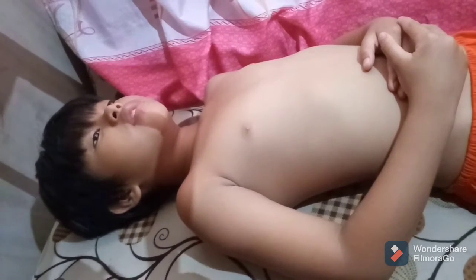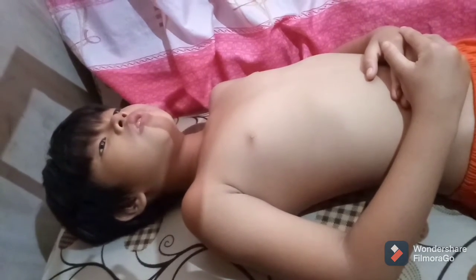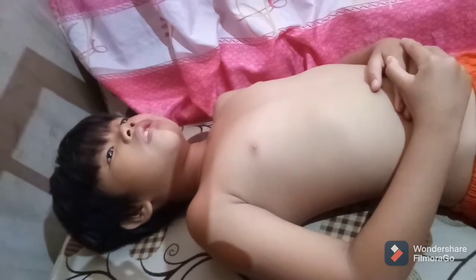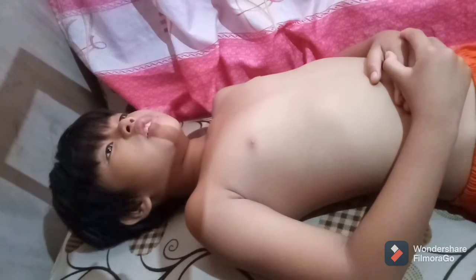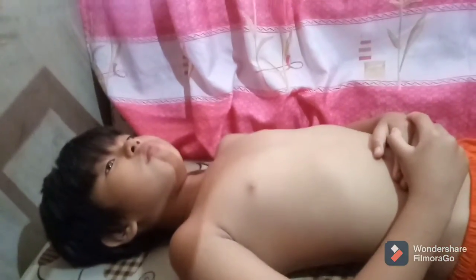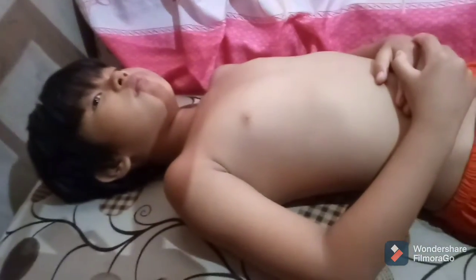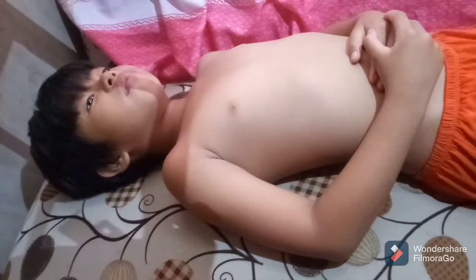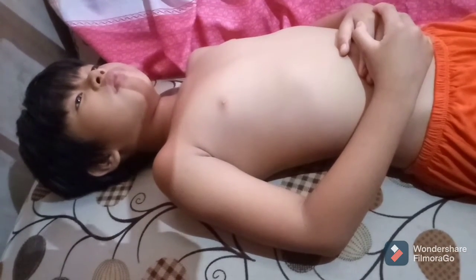For evaluation criteria, the entire skull, including the cranial and facial bones, must be clearly demonstrated. No rotation occurs, as evidenced by symmetric orbits at equal distances from the outer skull margins. For the AP projection of the skull, the petrous ridges superimpose the superior orbital margins.